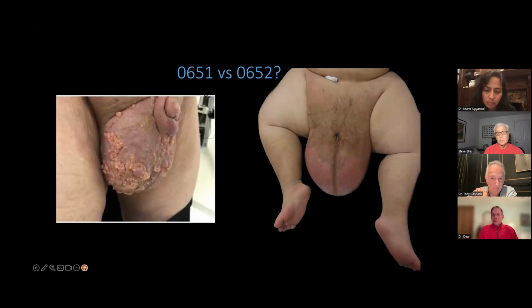All right, tough choice here, 651 or a 652. Gosh, two highly illustrative cases of just unfortunate disfiguring scrotal lymphedema. And this really should be a slam dunk case of you go right to a 652. A 651 is not going to be an appropriate pump because remember, all you have is a leg sleeve that extends to the inguinal ligament. So it's not going to affect change. You need a pelvic sleeve right across that swollen scrotum. And then the other problem you run into is that 651 sleeve may actually worsen the scrotal edema without preparatory pelvic clearing through a pelvic sleeve provided by a 652 device.